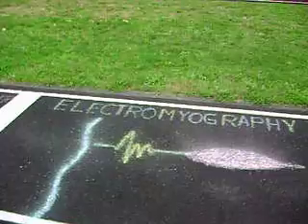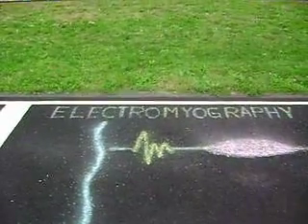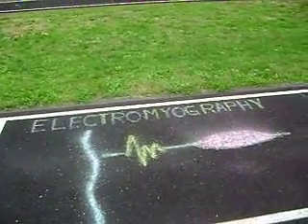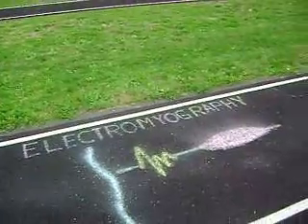Thus, the H reflex is the electrical equivalent of the ankle reflex, and the response disappears in peripheral neuropathies or S1 radiculopathy. The H reflex can be normally absent in persons over the age of 60.